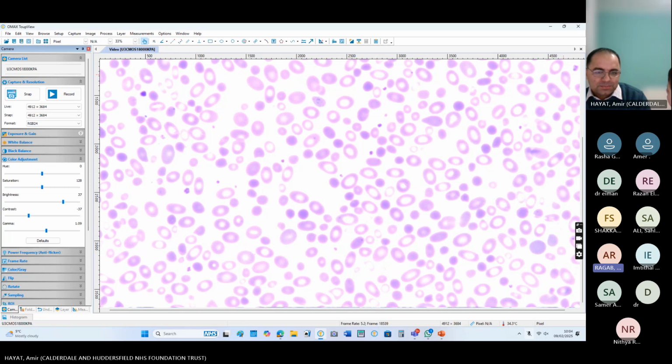There are many elliptocyte-like cells, and occasional teardrop-like cells. Yeah, features are going with likely hemolysis. Yes, hemolytic anemia. But what type of hemolytic anemia?